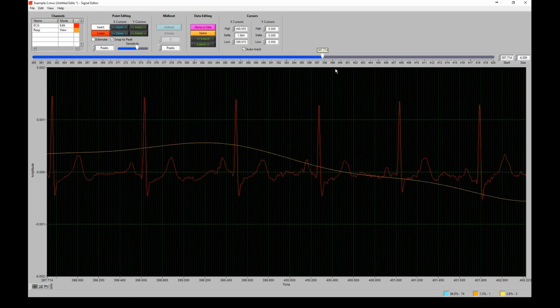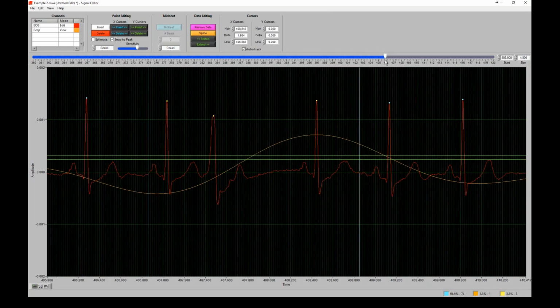So we want to go through and find the second occurrence of this arrhythmia. That's another thing we're going to see commonly when we have these sorts of segments is they're going to happen over and over again. You're going to see them throughout a segment, throughout a participant's file. And that's another indicator that you are dealing with some sort of cardiac arrhythmia and not just some abnormal morphology or noise.